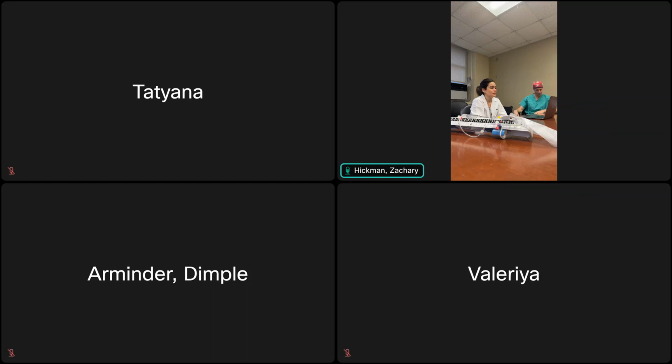Anyway, okay, so we can go back now to what we do when we receive a patient, or when we go to the bedside for the first time to assess a patient who had an EVD placed. What do we want to check? We want to check the positioning, making sure it's zeroed to the tragus, and also that it's at the desired level that you want. And make sure it's open.